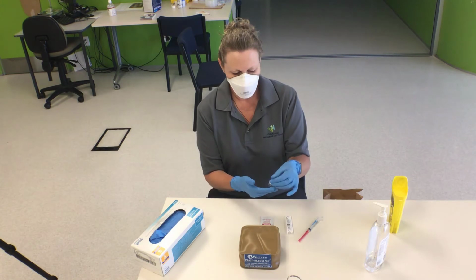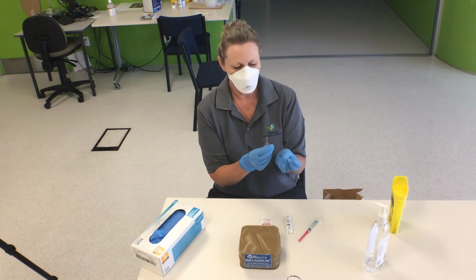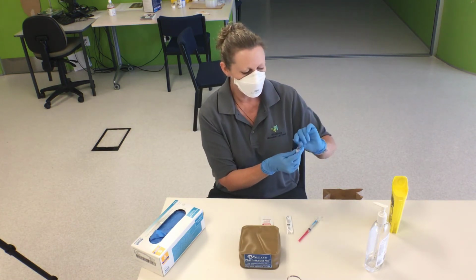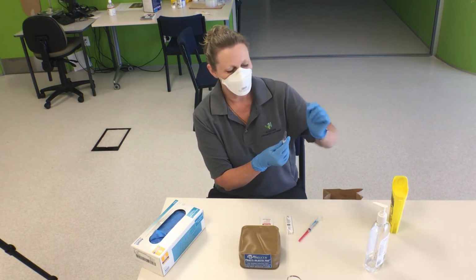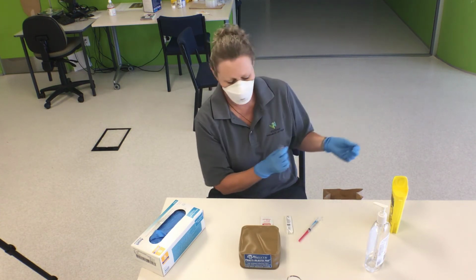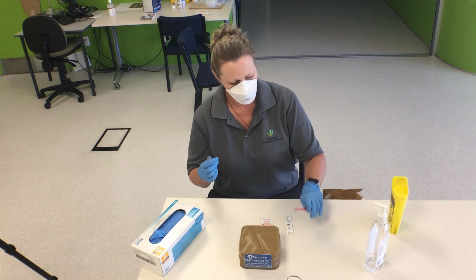So I've got my medication, it has been checked, and just when you're opening an ampule, if there is a dot on the ampule, make sure that your thumb is on the opposite side to the dot. I like to always make sure that I'm not facing anyone as I pop that ampule, and I now have a sharp.